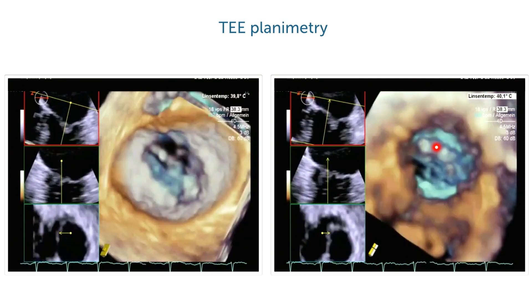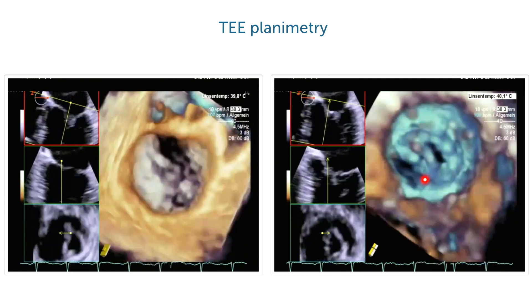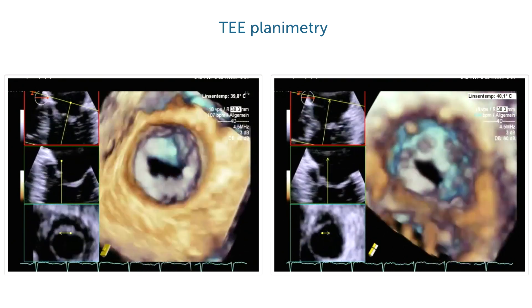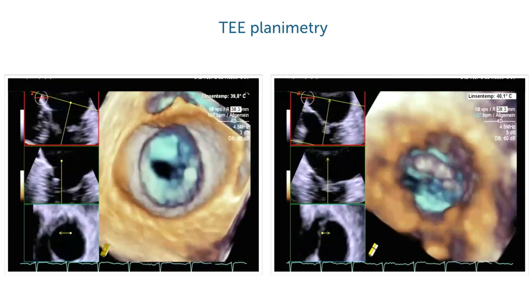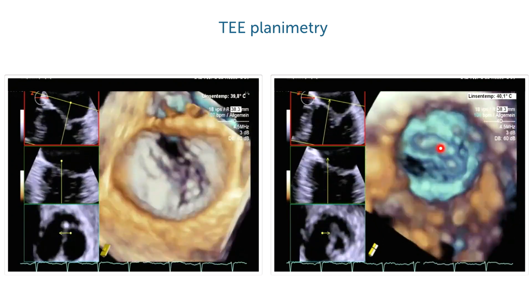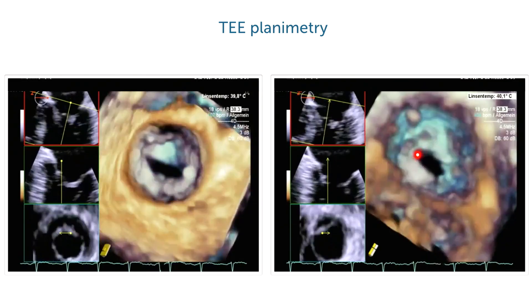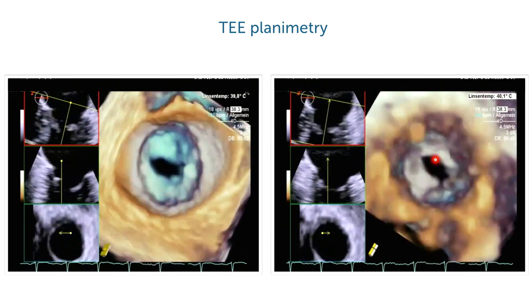Here is the same valve now looking from the left ventricle up toward the mitral valve into the left atrium. Again we can see the doming, and we can nicely appreciate the size of the orifice.